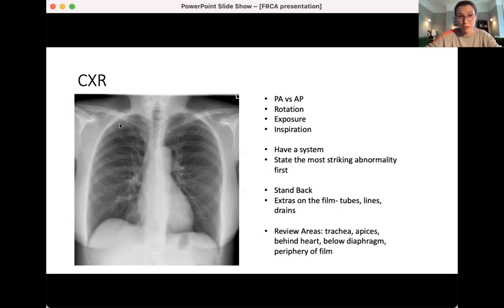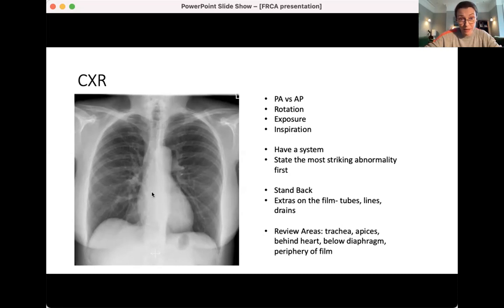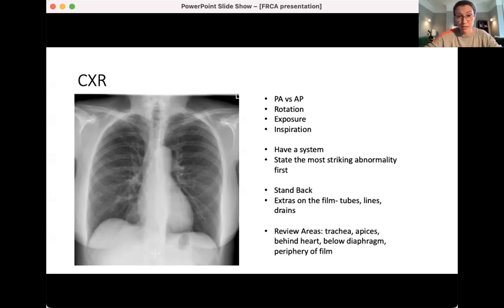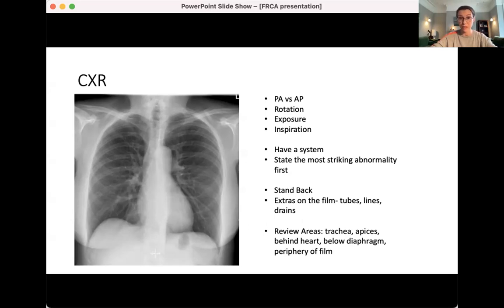You can't accurately interpret heart size on an AP projection. Think about other technical factors: if you're concerned about rotation, look for the medial ends of the clavicle and the trachea centrally — does it look central or rotated? On a good quality film you should be able to see the vertebral bodies through the mediastinum. Think about the degree of inspiration — you will never see a full inspiration on an intensive care patient.